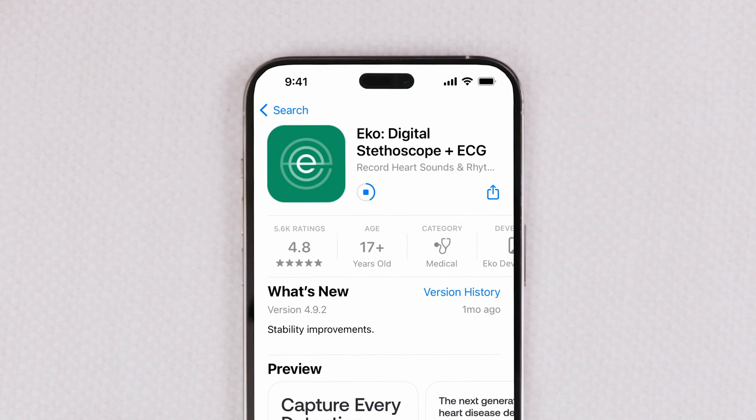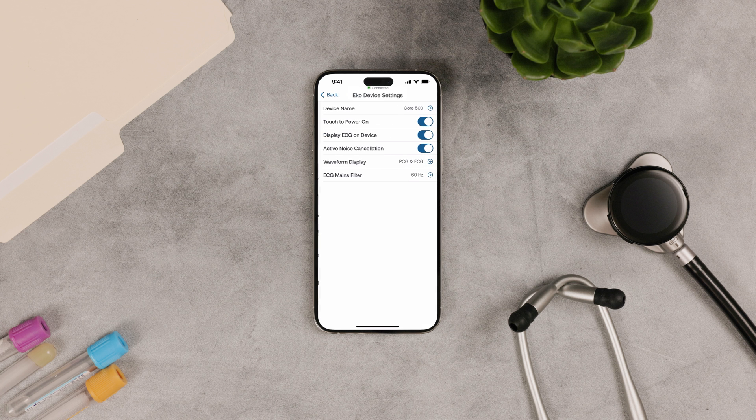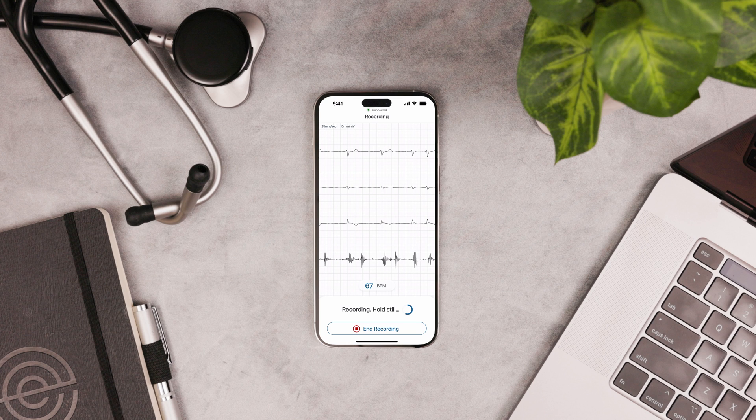You'll need to use the Eko app to finish the Core 500 setup. The app is required to take recordings with the Core 500 and view AI results on the device's screen. You'll also need it to visualize the 3 lead ECG.